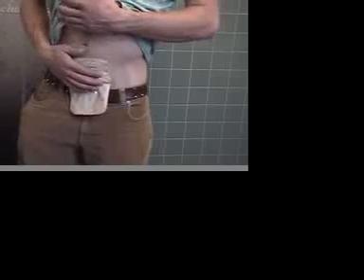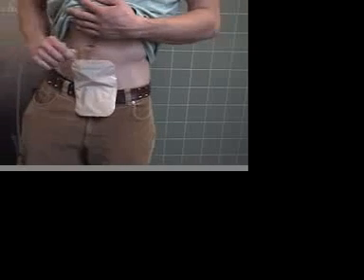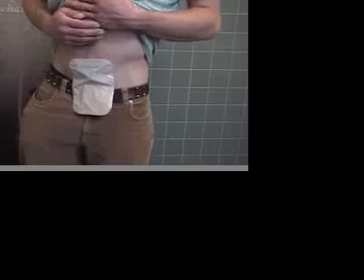And I'll sit there until I feel my system's completed its output, and then I'll switch. I'll still be sitting on the toilet. I'll pull the bag off carefully when I know that nothing's going to be coming out and I have a moment, and switch to an 8-inch bag. That's the part that you've got to do quickly and smoothly, just in case you have any surprises. I'll wear this until I know my system's completely taken care of. Usually it takes about an hour before I know that I'm completely free, and then I'll switch to the StomaCap for the rest of the next day.